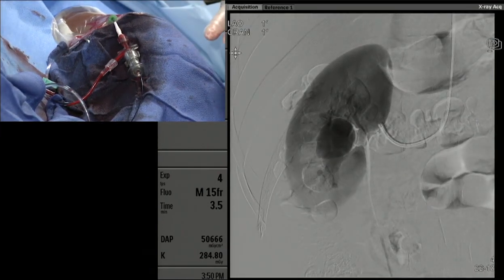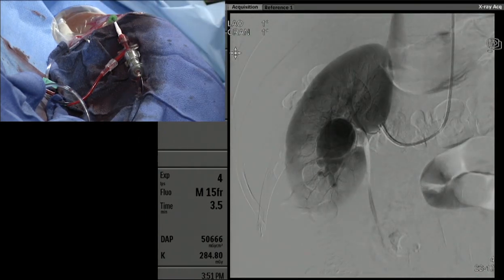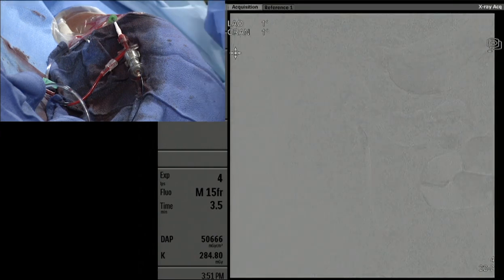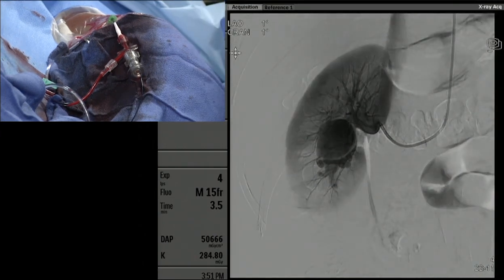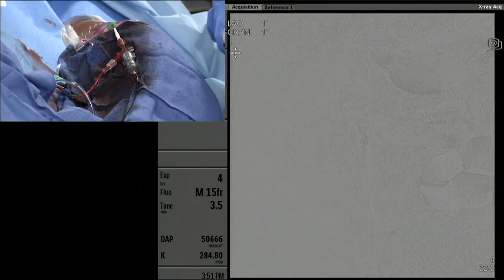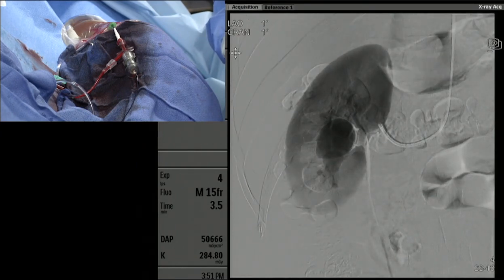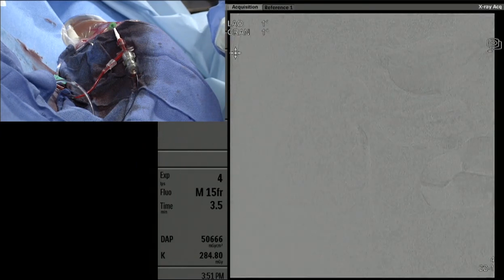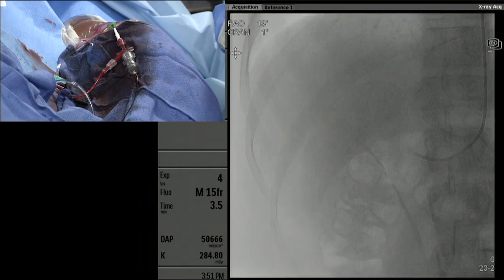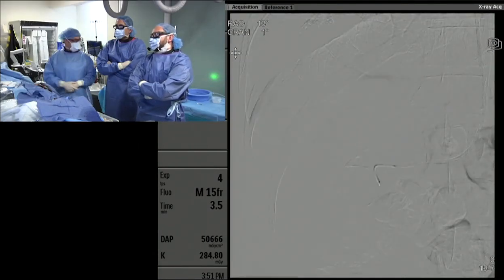And you can see based on the angiogram, it's pretty obvious that there's basically a paucity of flow to the lower lobe because of the shunting at the lower pole. And so that's really what the major finding is here, plus that big venous aneurysm, or varix you would call it, related to the fistula, and then rapid filling of the IVC. So that's where we're at. We have a microcatheter very nicely seated into that lower pole branch, and so we're going to sort of defer to the panel as to how we should embolize this.